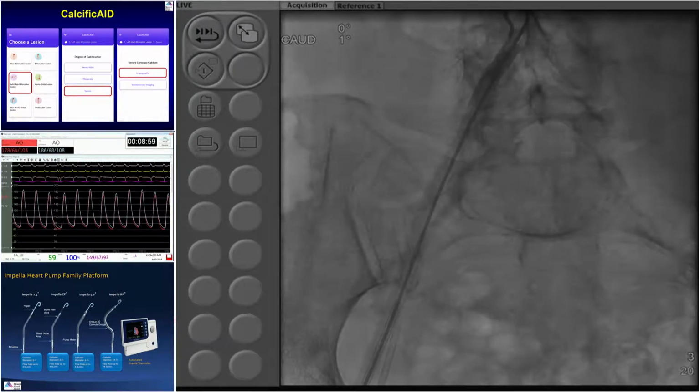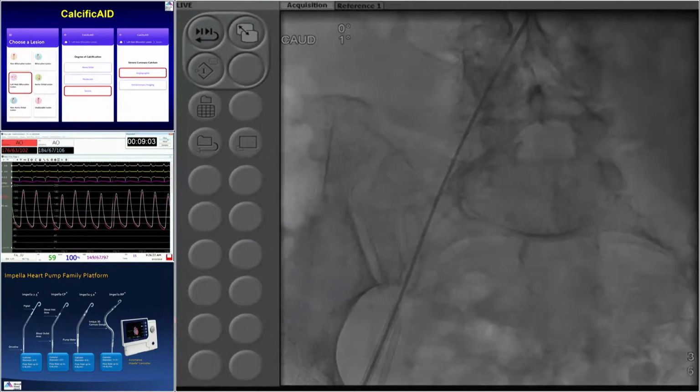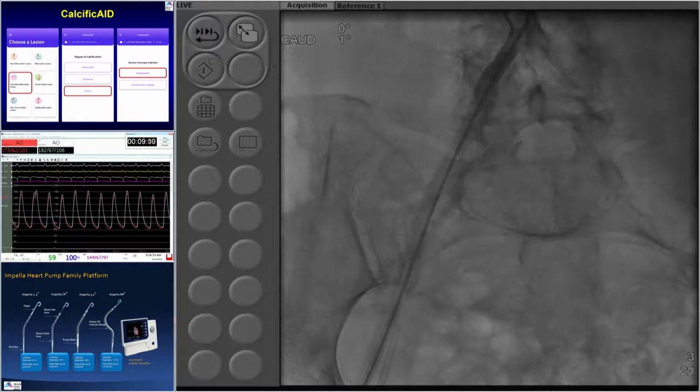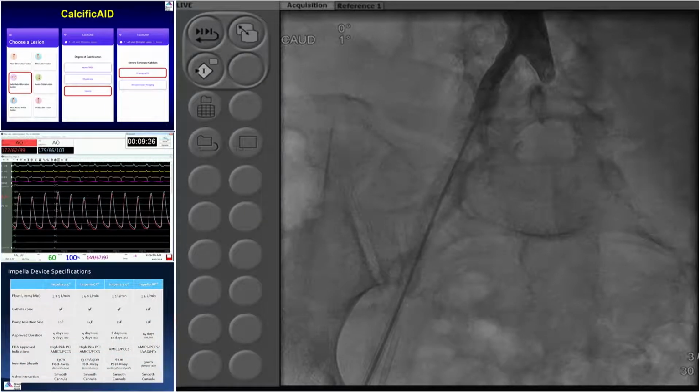But what is the disadvantage? And we know that it is FDA approved for normal ejection fraction with complex anatomy. This case actually was even presented to surgical colleagues, and they said, since the LIMA is patent, nothing needs to be done, you guys do the intervention. And the only indication here is the potential hemodynamic compromise from increasing regurgitation in very complex left main, circumflex, and trifurcating OM and LPL.